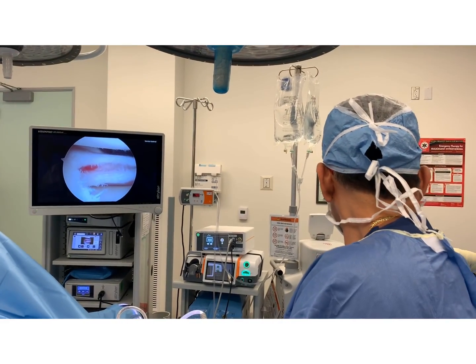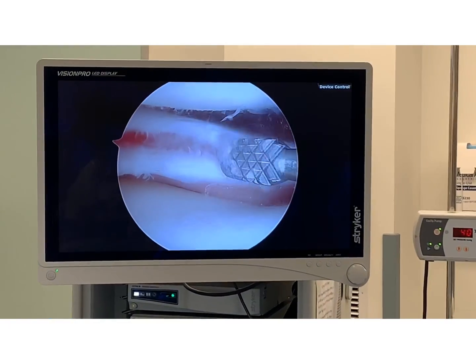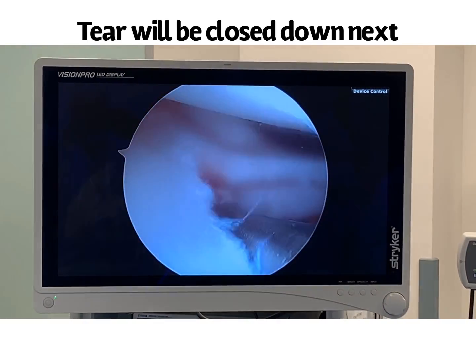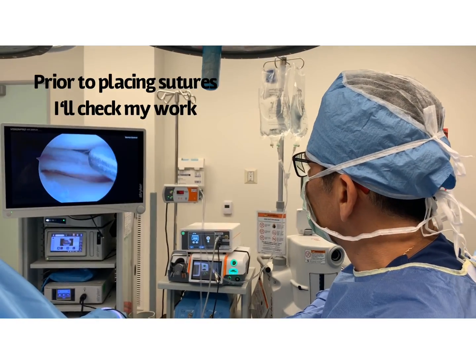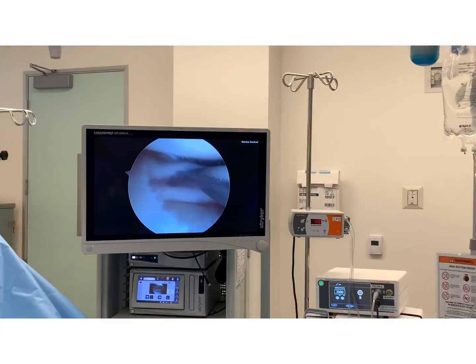So before it's tied together, I have to stimulate the area to create some bleeding, and that's why there's already bleeding there. I use a needle as well as an instrument called a rasp — it's a rough-ended instrument and I just rough the area up. Then after this I tie it together and that'll be the meniscus repair. Now I'm going to check my work and see how well I've done in terms of creating a bleeding bed.